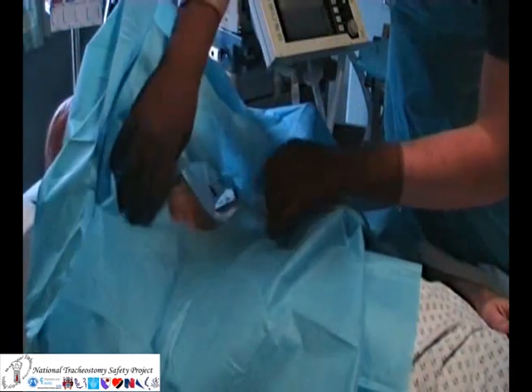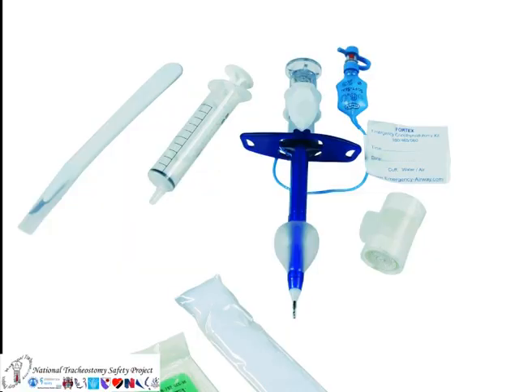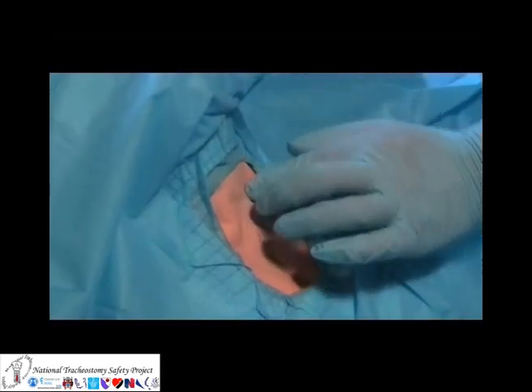This sequence shows cricothyroidotomy using a PORTEX PCK cricothyroidotomy kit. This is a wide bore cannula over needle device.